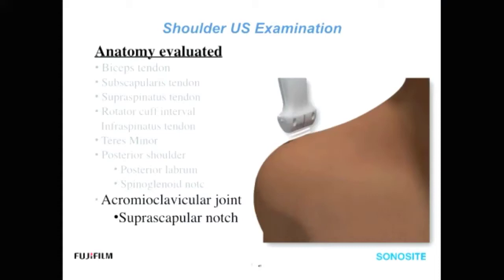And then while we're in that area, we're just going to translate the transducer a little bit anterior, and we're going to aim the beam somewhat towards the coracoid, and we're going to be scanning the suprascapular notch. So just knowing that that could contribute to other pain generators in the area. So we'll keep it short and sweet today and rely heavily on Q&A.